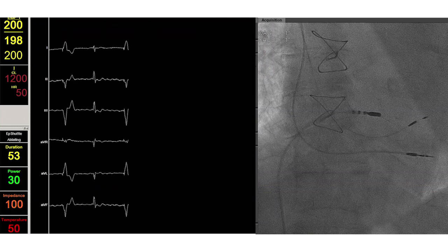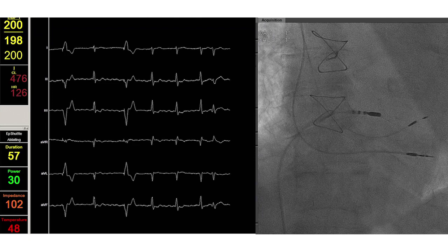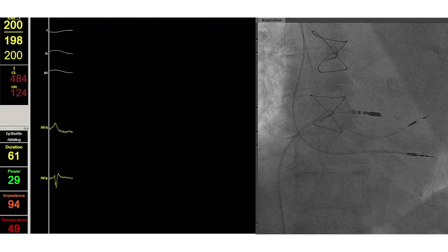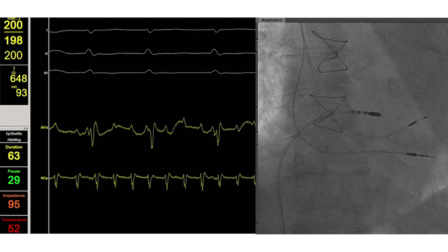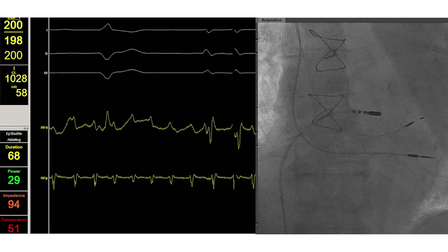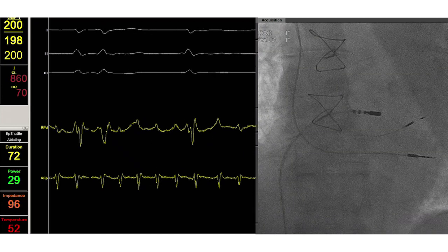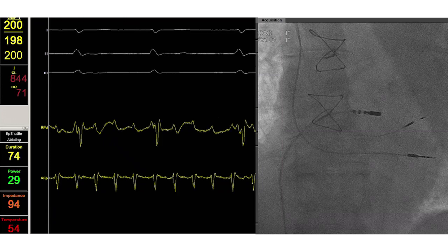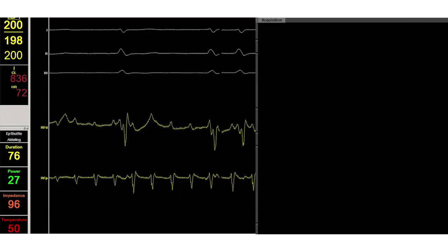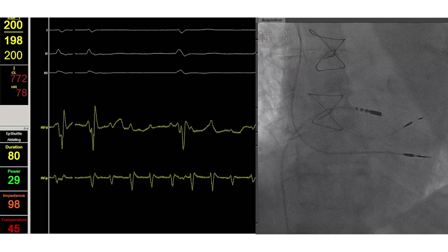However, the ECG shows that there is again AV nodal conduction. So slight catheter movements will be needed to get closer to the target zone. Slight rotation of the ablation catheter while observing changes in electrogram or fluoroscopy will mostly do the trick, even though it may be difficult to reach the AV node in some cases.